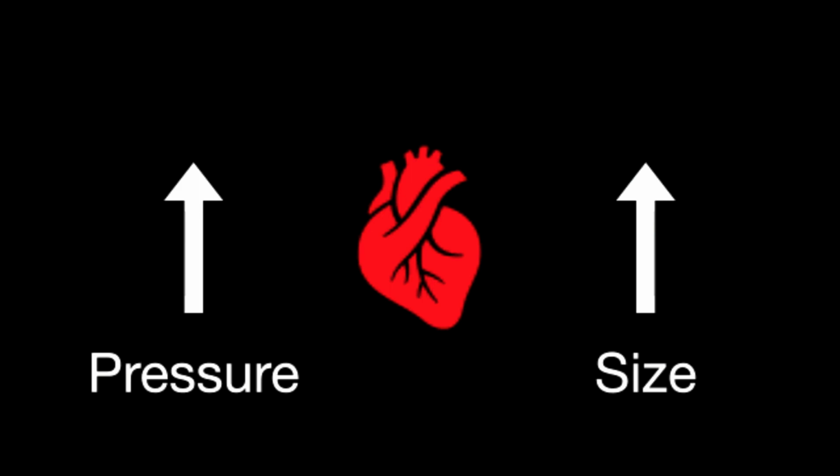So it's less likely the right ventricle will dilate in the face of an acute pressure overload, especially if it is hypertrophied, because it has a significantly larger radius, but at the same time the wall thickness is increased, and it's much less likely to actually become more dilated. So I don't know if that answered your question, but it was a long circuitous answer.